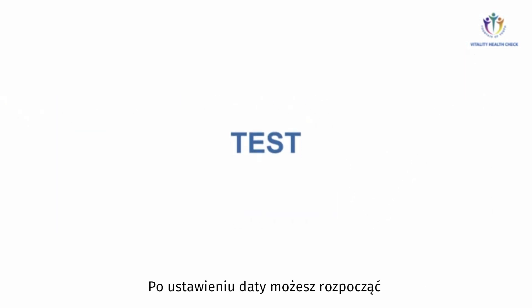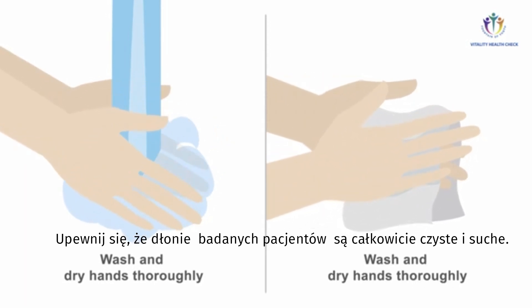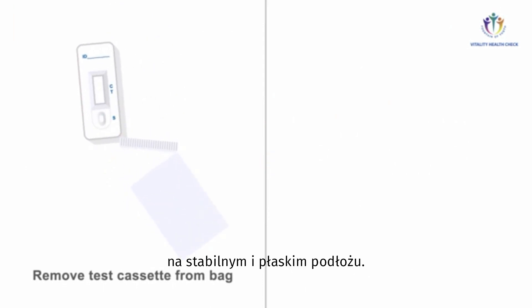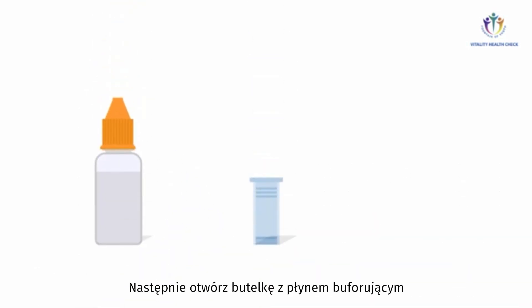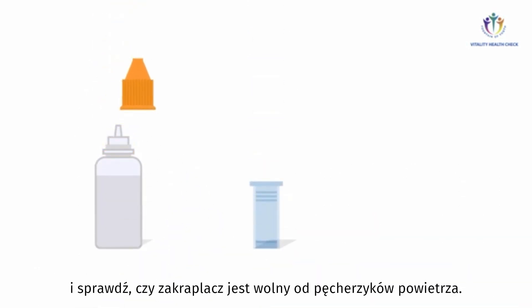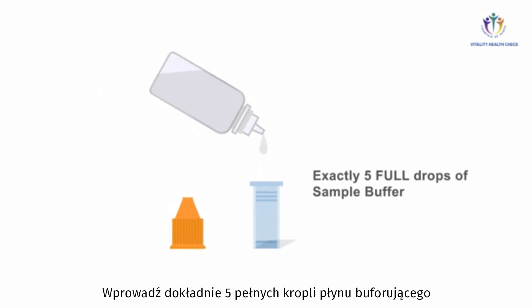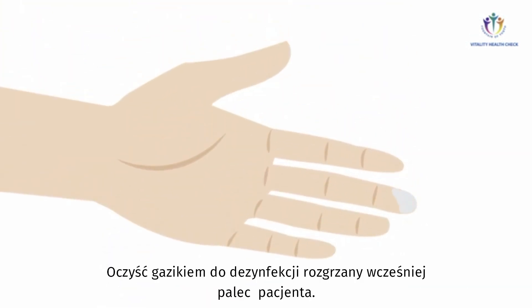After setting the date, you are now ready to run a first test. Make sure the subject's hands are thoroughly cleaned and dried. Remove a test cassette from the sealed bag and place it on a stable surface. Prepare one unisampler device for sampling. Open the sample buffer bottle and check that its outlet is bubble-free. Place exactly five full drops of sample buffer into the collection tube of the unisampler.